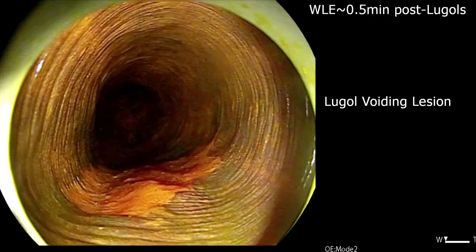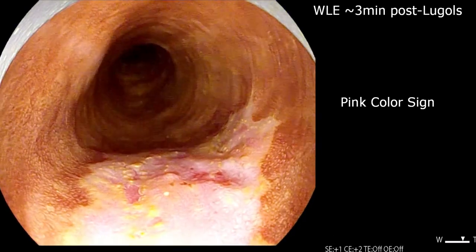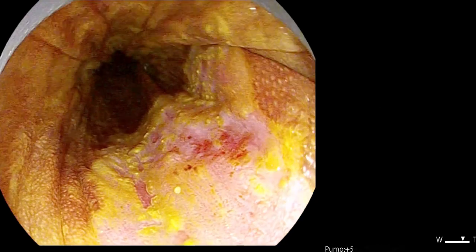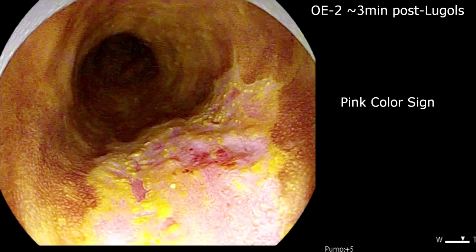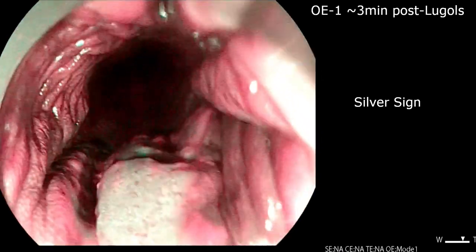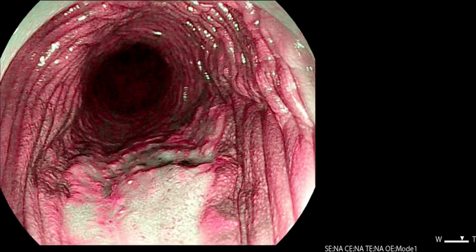This is also appreciated with Optical Enhancement Mode 2. At 3 minutes with white light, the lesion demonstrates the pink colour sign, which is strongly indicative of at least mucosal carcinoma. The pink colour sign is further enhanced with Optical Enhancement Mode 2. Using Optical Enhancement Mode 1, the silver sign is demonstrated, which is the equivalent of the pink colour sign in that it indicates at least mucosal carcinoma.